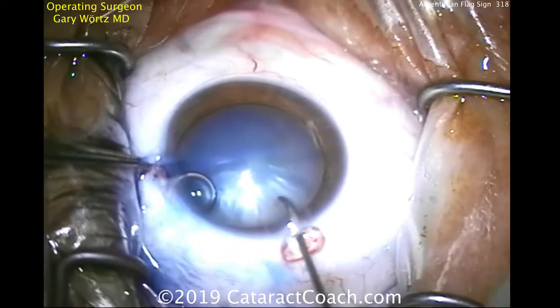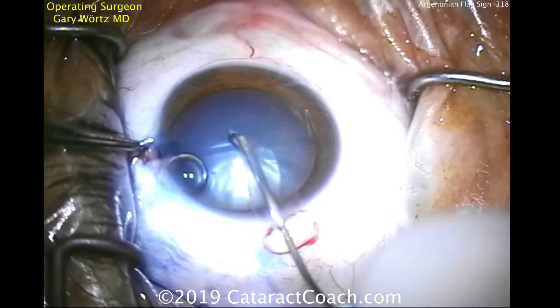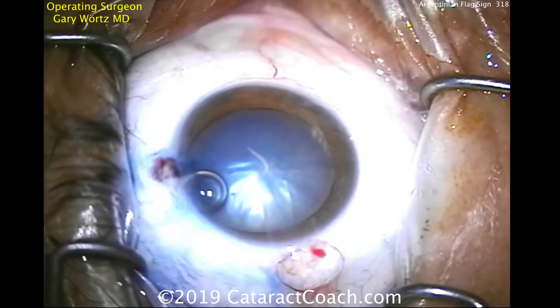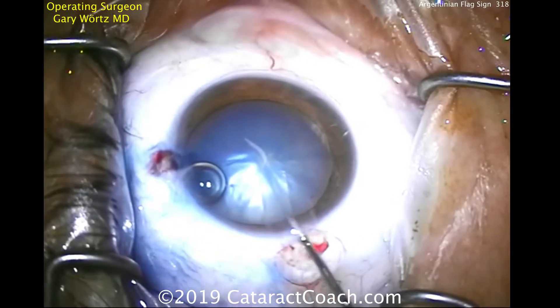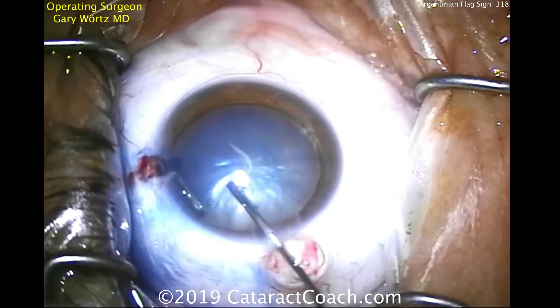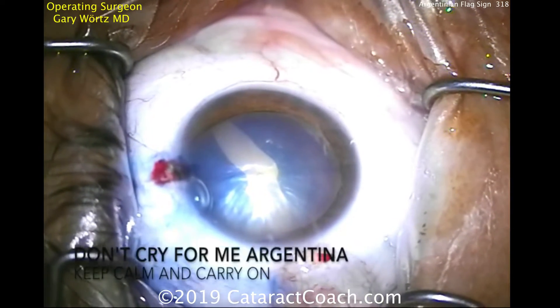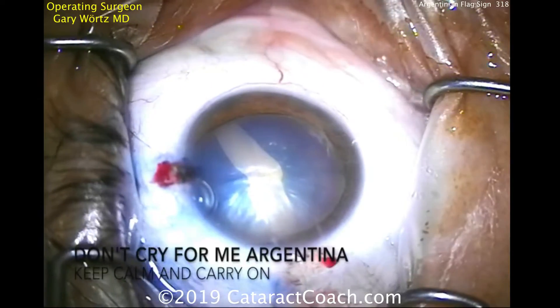Watch carefully. Just as he starts, that posterior pressure from the lens is going to push upwards and it's already starting to radialize. He'll put more viscoelastic and try to tamponade it, but it's too late. There it goes — now it's split completely, equator to equator right across.